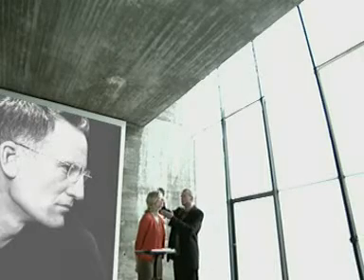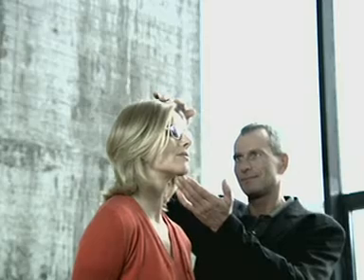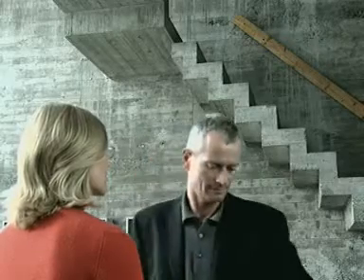You can naturally determine the pantoscopic tilt of the pre-fitted frame with the method of your choice. We would like to show you a simple method to determine the pantoscopic tilt not in degrees but in millimeters. First, mark the point of vision on the lens with the eyes looking straight ahead and the frame plane in the perpendicular position, as when fitting aspheric SV lenses.